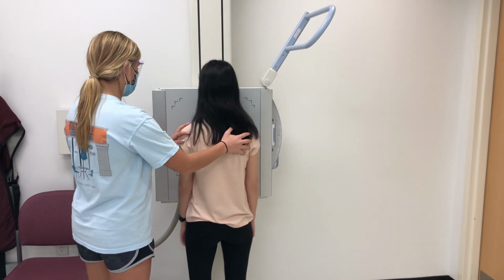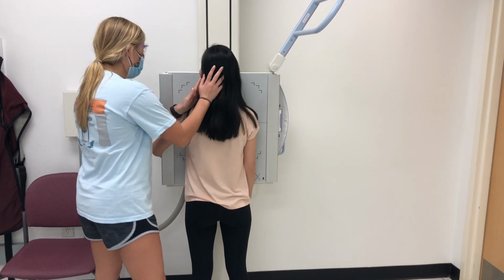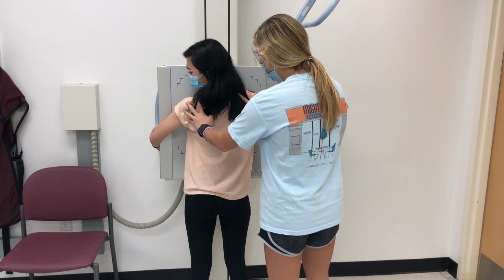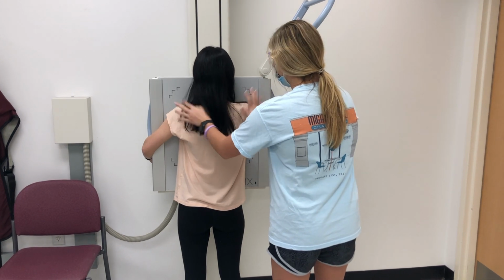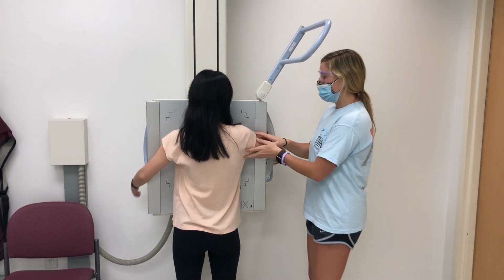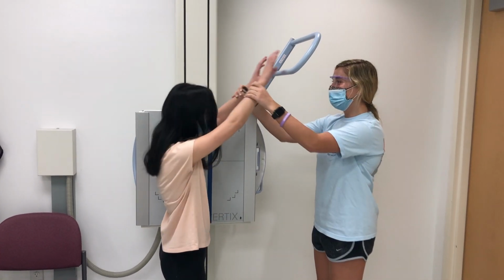The most common pediatric x-ray order is the chest x-ray. Communication is vital to get the patient to hold still and make sure that the appropriate breathing techniques are used to obtain a quality image. Immobilization or parent assistance is often used to help the exam go smoothly. Be sure to use proper collimation and technique to reduce patient exposure.